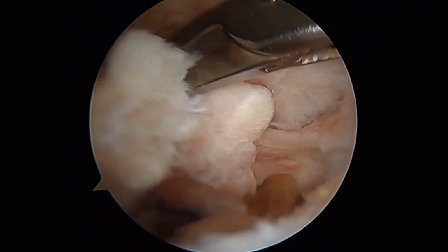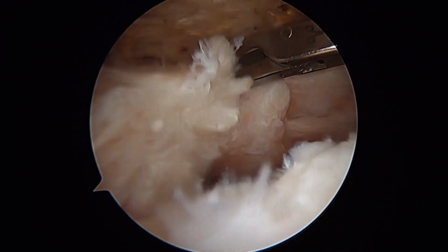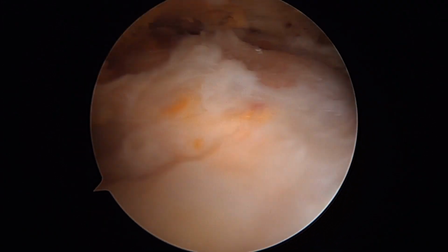Here we can see a torn rotator cuff tendon. A tissue grasper is taking the tendon tissue and reducing, or putting it back, in the position of its anatomic attachment, known as the greater tuberosity.